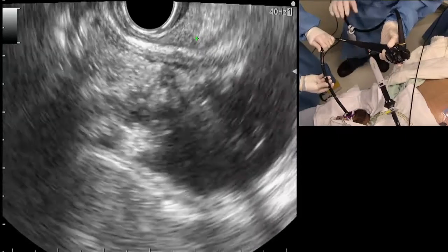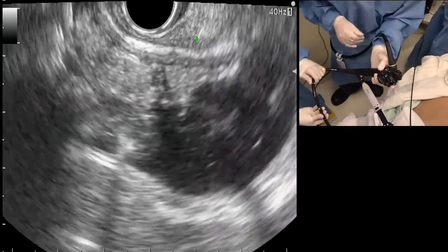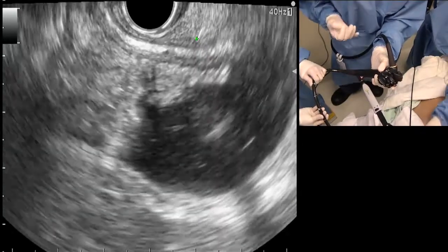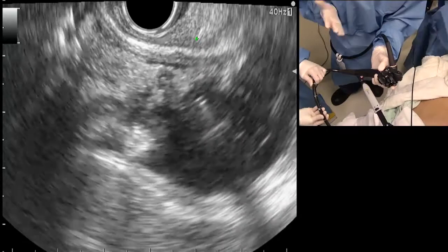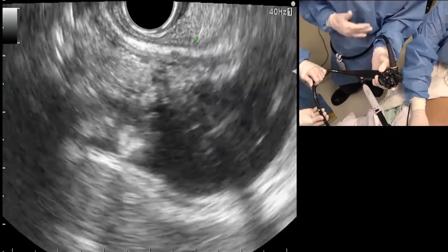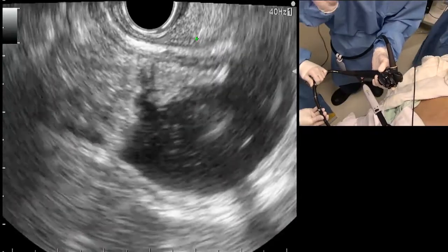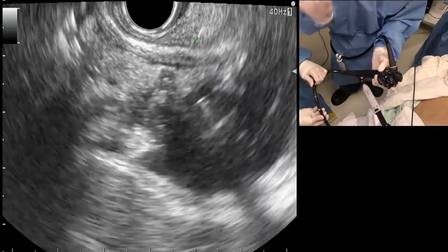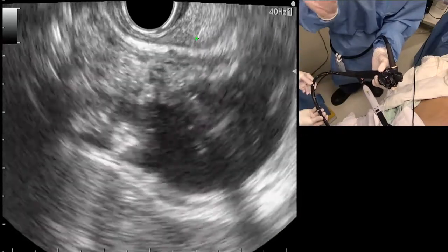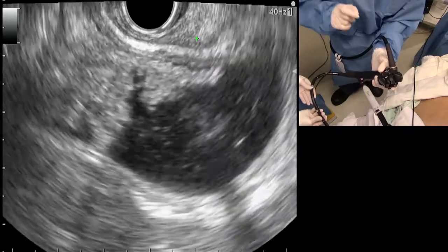Now, this is the part that is going to be the most difficult for anyone who starts doing this. You're going to worry if you're going to get in. So I can tell you there's a reason why it took 10 years to develop this, and that's because it went through a zillion iterations. These are fine micro wires that extend along the side of the sheath. It's bougie shaped at the very tip. The wires run along in a circular fashion at the very tip.